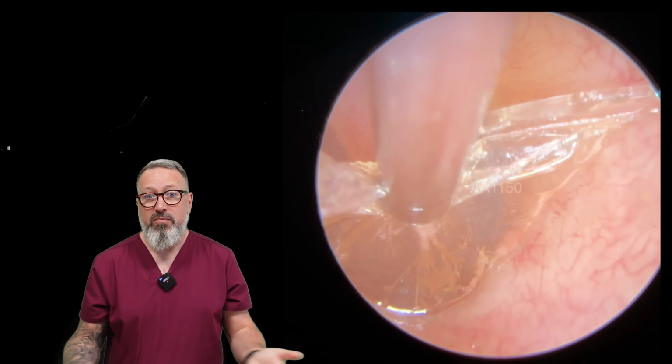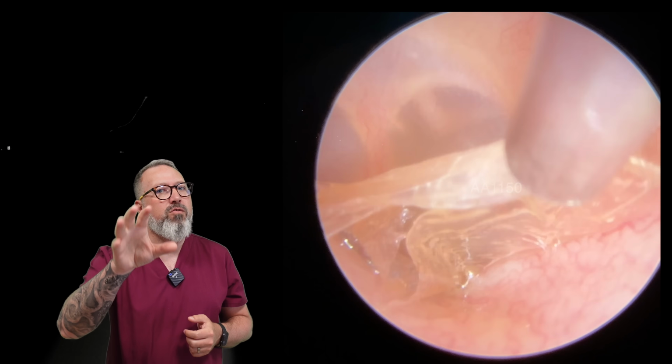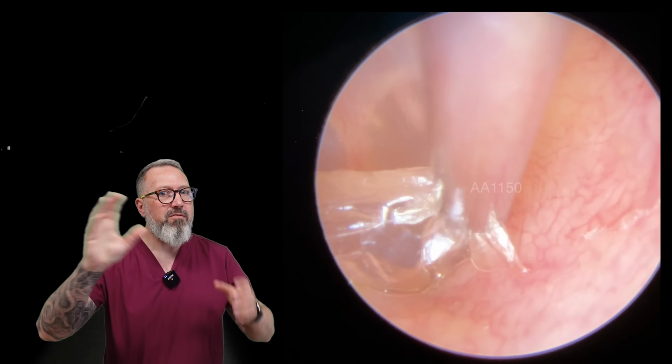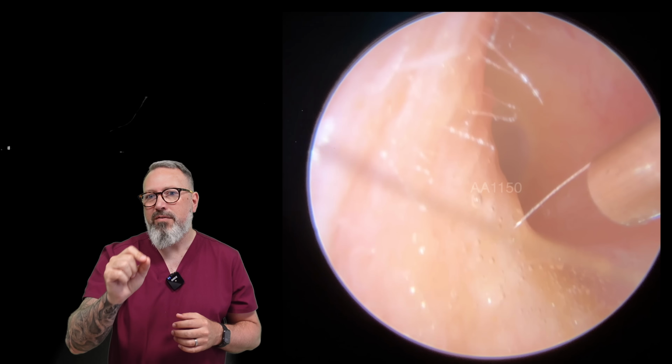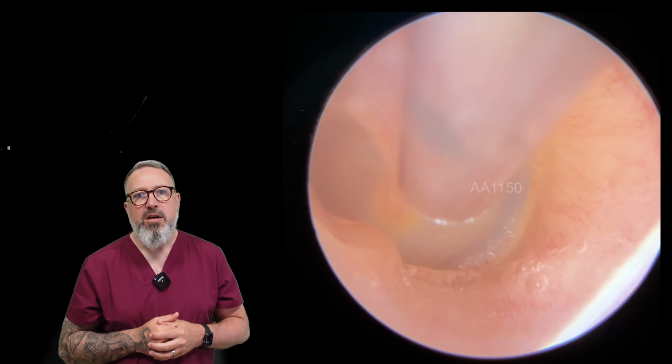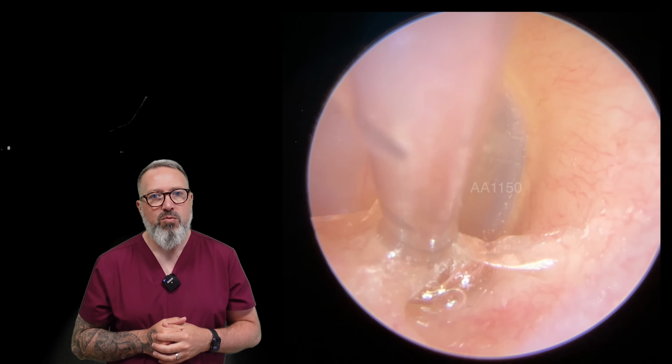Look how all of that, as soon as I put the suction tube in, everything drew in. Now this is where you've got to be really cautious about clarinetting, because everything is getting sucked inside the suction tube. And when you get these ridges there, that was a little bit of a clarinet. You had that squeak there as we pulled. So I've popped some oil in. I tend to find that helps with clarinetting skin, especially these thin wispy layers.